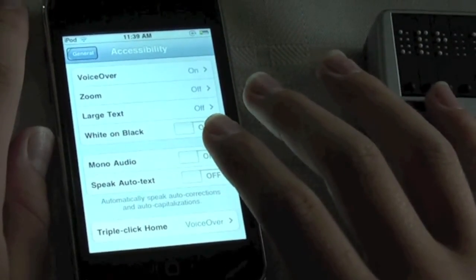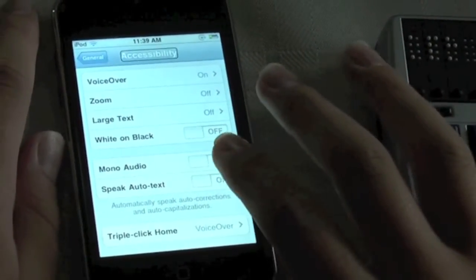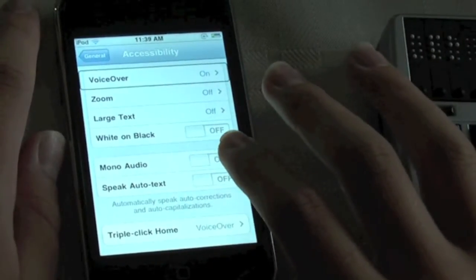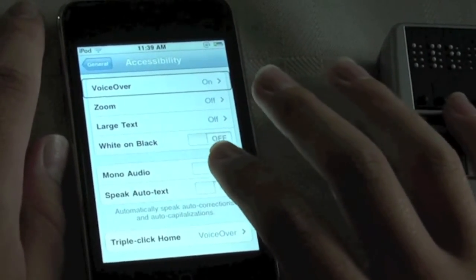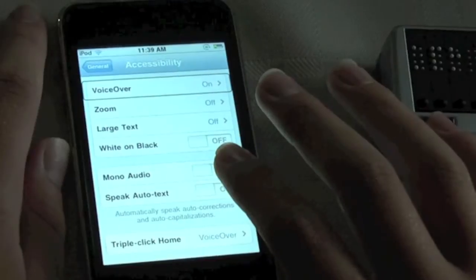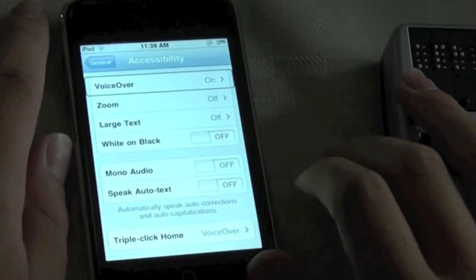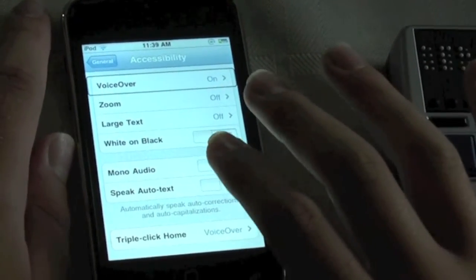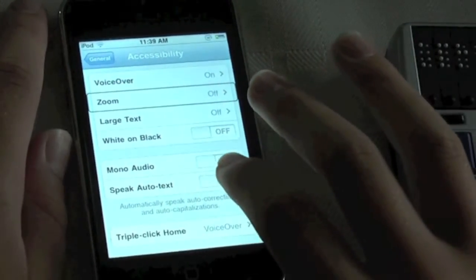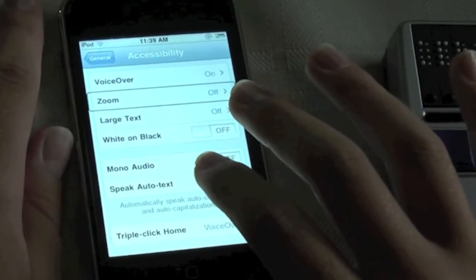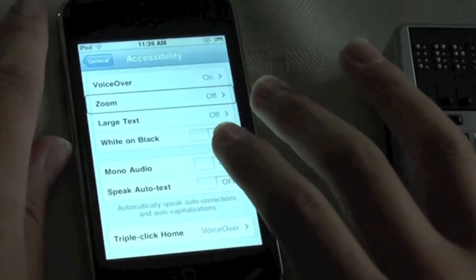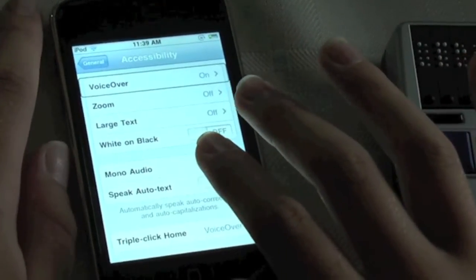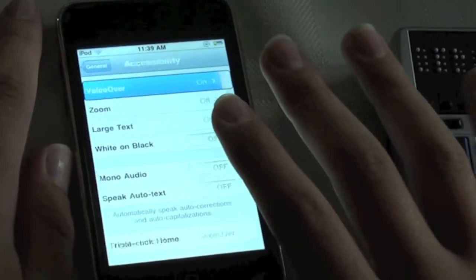Now we need to go into VoiceOver. VoiceOver if you do not know is the built-in screen reader on these devices and that is what the Refreshabraille 18 will connect with. We also have things like the mono audio and the magnifier called Zoom, but we go into VoiceOver by double tapping.